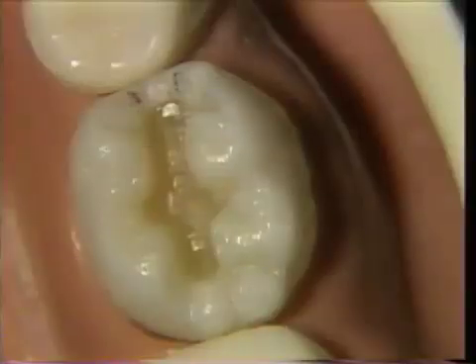The proximal box portion of the Class 2 cavity preparation should be considered as simply an extension of a Class 1. Therefore, before the development of the proximal box has begun, the Class 1 portion of the preparation should be completed.